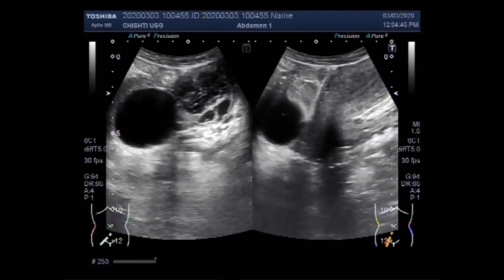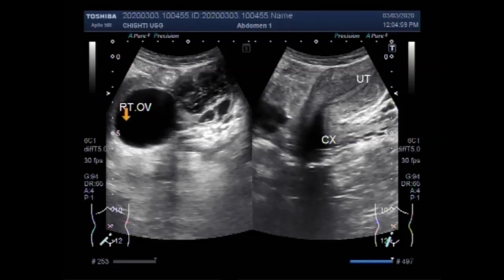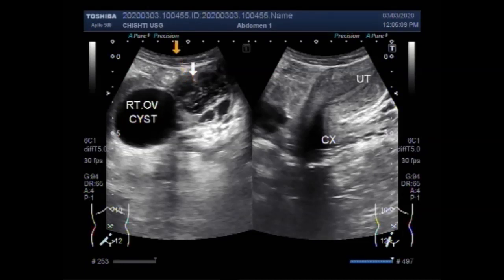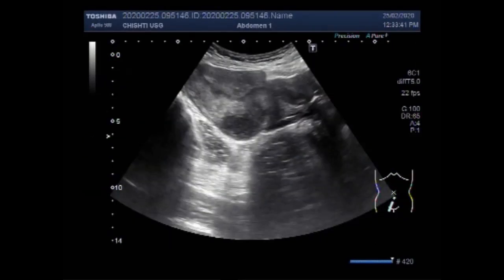You can see the uterus, the cervix, the follicular simple ovarian cyst, and the hemorrhagic ovarian cyst. This is the right ovarian hemorrhagic cyst. This first video is now concluding.